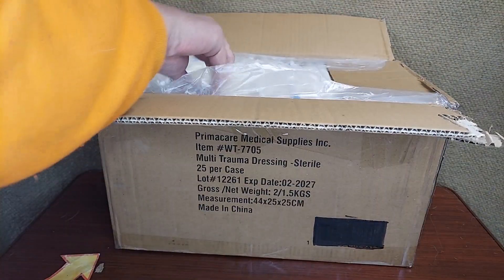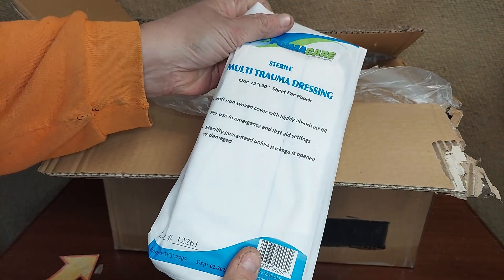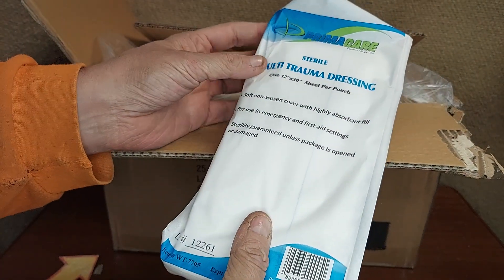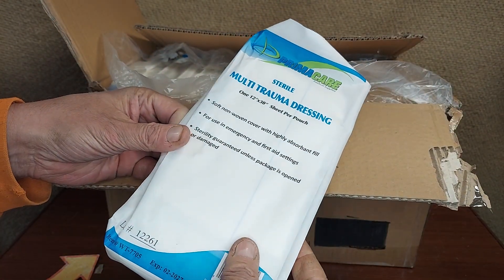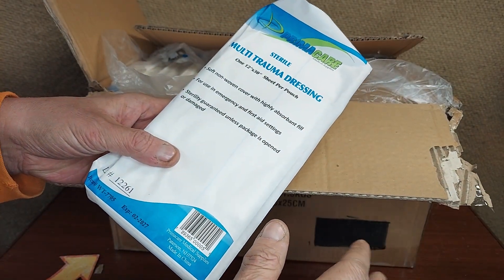Opening them up, you get 25 of these multi-trauma sterile dressings. These are essentially a big sterile pad — they're 12 inches by 30 inches.